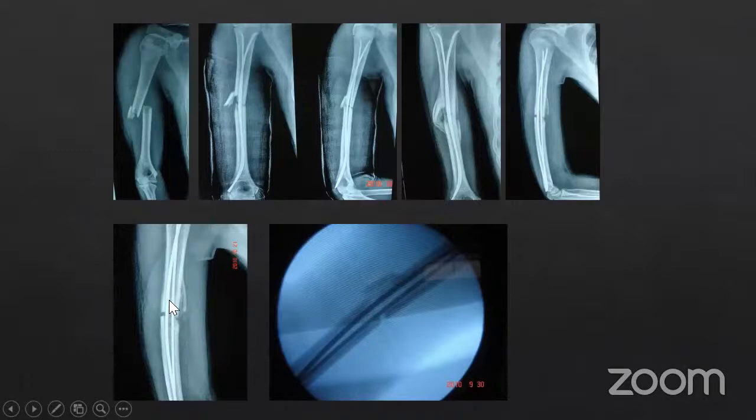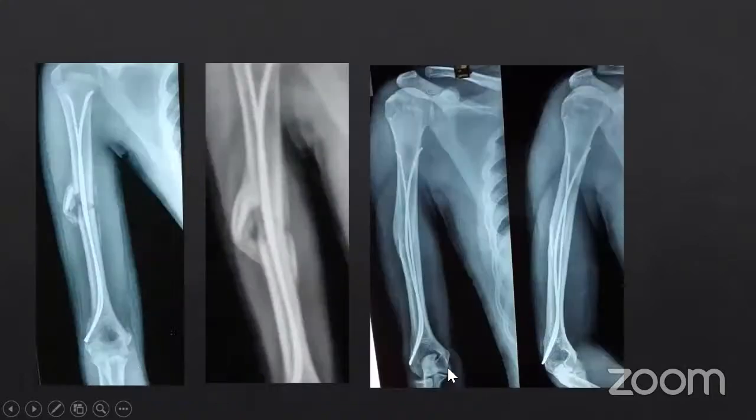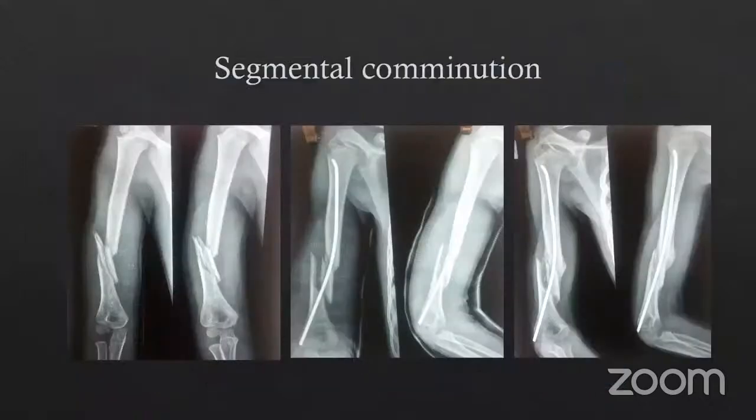So to counter the effect of comminution, which may cause a valgus, I contoured the thicker nail and turned it around into an S fashion. So one C nail, which was thinner, and an S nail, which was thicker, to counter the valgus. And using these principles, we could stabilize the fracture. You can see this spindle here, and you can see the thicker nail on the outer side. And that is how it healed with excellent incorporation and remodeling over a period of time.